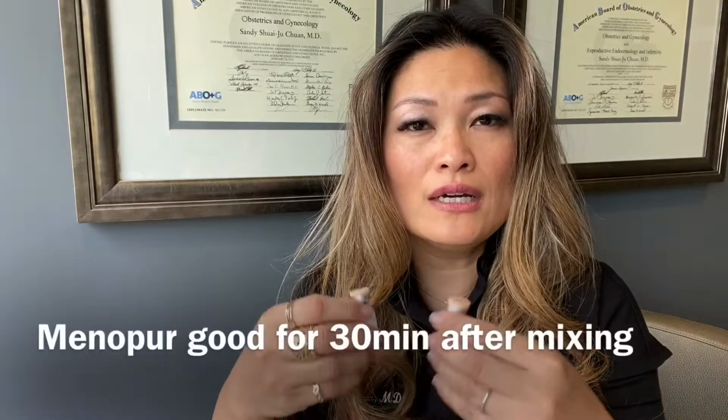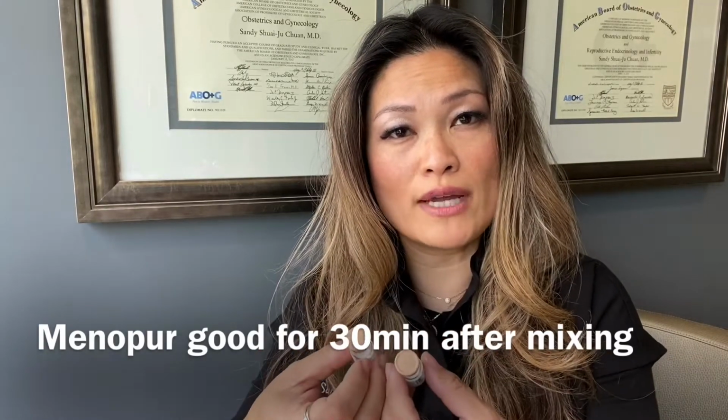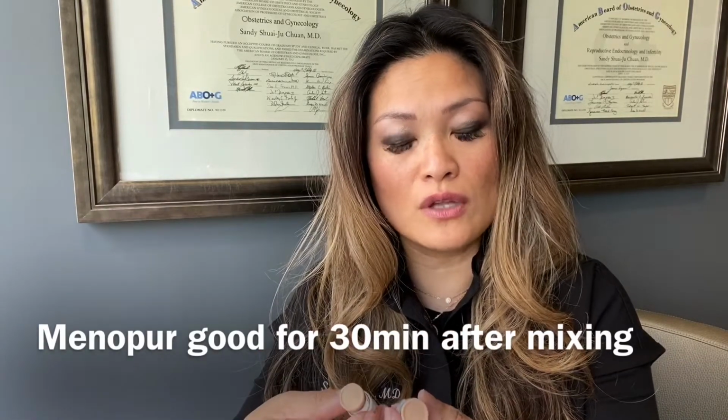Once you mix the Menopur, it is good for about 30 minutes. So you really want to mix this right before you're ready to use it. You don't want to leave it out for too long. And I'm going to go ahead and also tell you the other tools that you need to draw up the Menopur. So you will have been given usually a syringe as well as a needle.